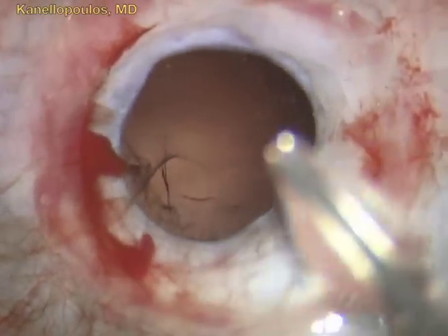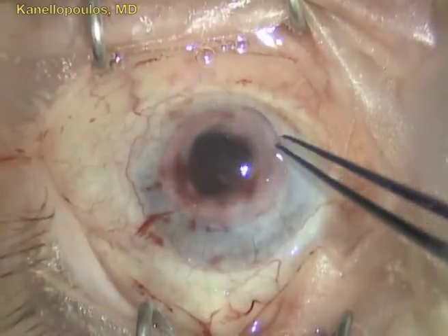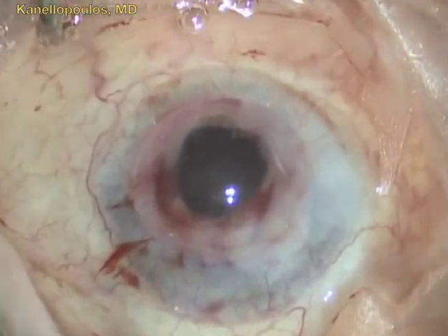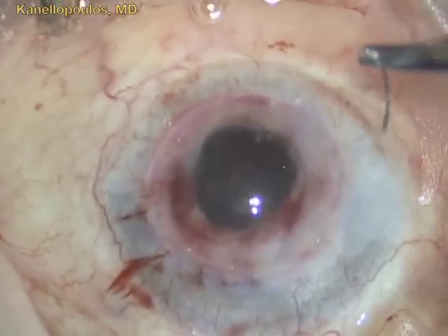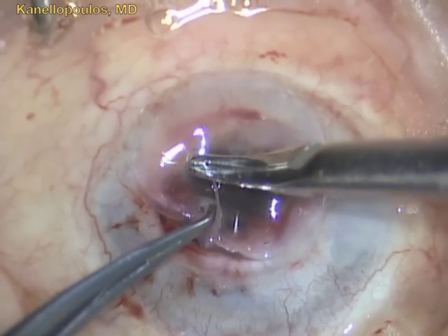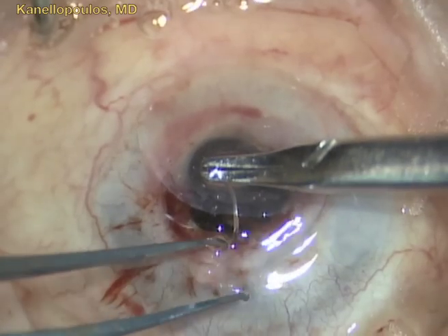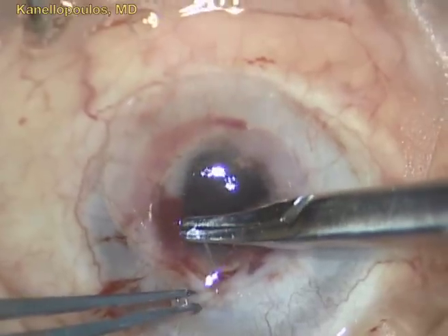We're doing some gonioplasty with viscoelastic. We're placing the donor cornea in place — brilliant tissue, by the way, four days old. It still amazes me how this tissue originates in Denver and ends up in Athens within four days' time from preservation.